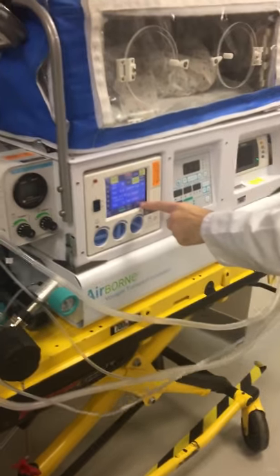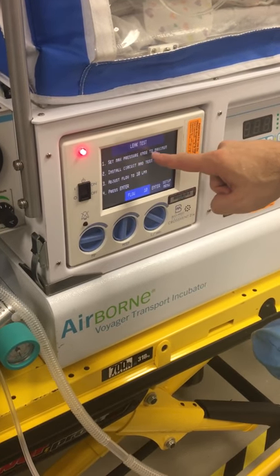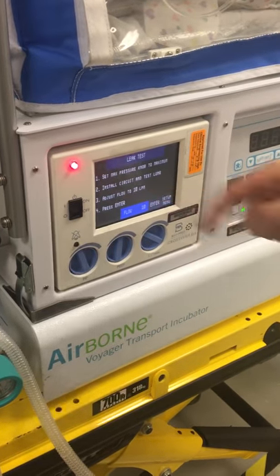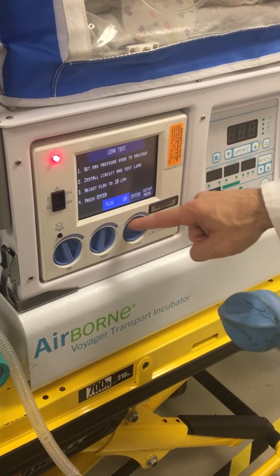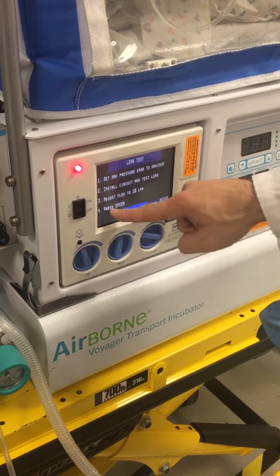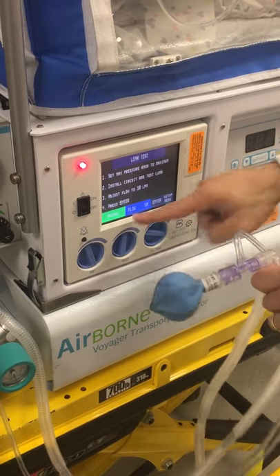We have our test lung in here and we're going to turn on the cross vent. When we do that we'll hit set up right here, and then we're going to do a leak test. Set the max pressure knob to maximum — this is our peak inspiratory pressure knob. Install the circuit and test lung. Adjust flow to 10 liters per minute using this flow knob right here, then press enter and it's going to run a leak test. Passed.